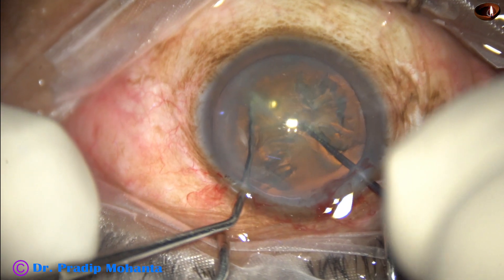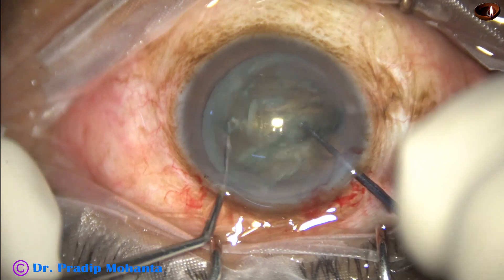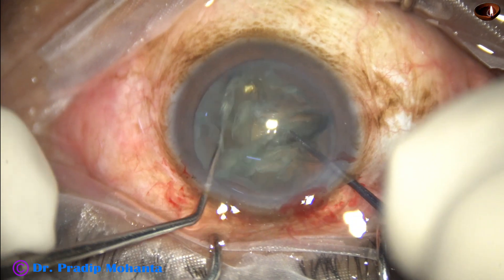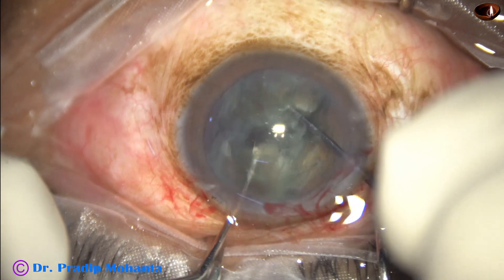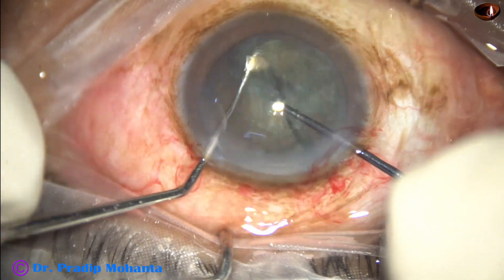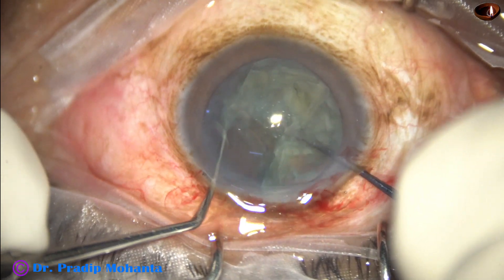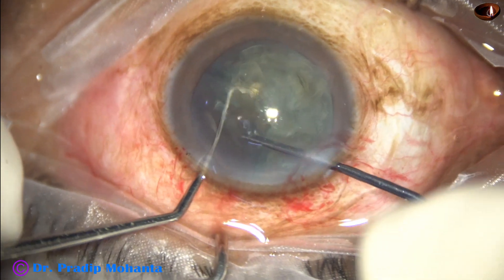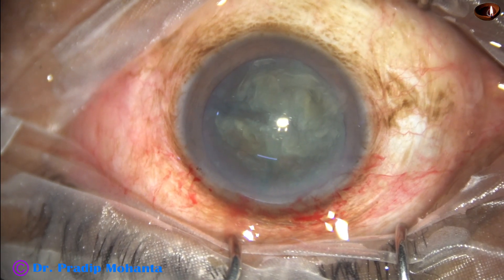The sustainer hooks the opposite equator and the two instruments come toward each other. The nucleus is divided into two heminuclei. Then the equator of one heminucleus is hooked and subdivided into two fragments. The nucleus is then rotated, the other heminucleus is hooked and subdivided into two fragments — so we have four fragments in no time.